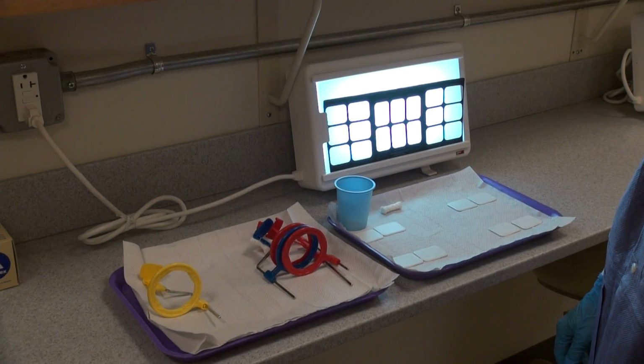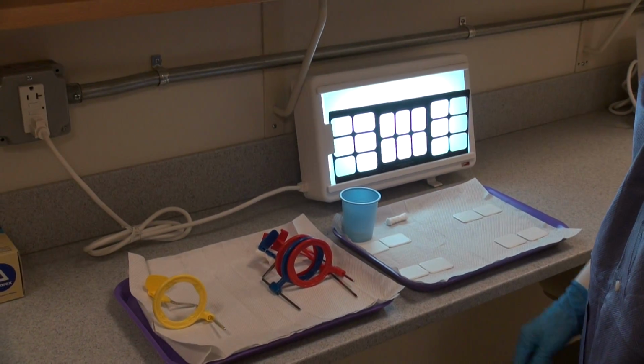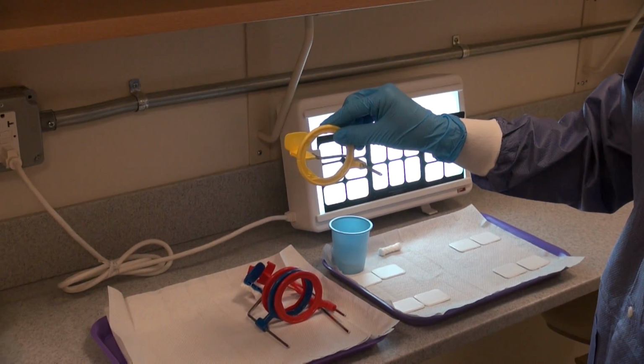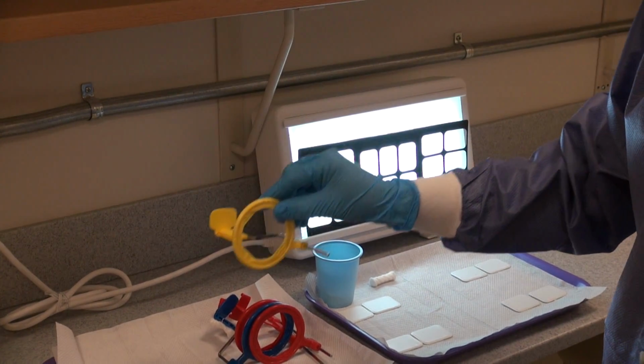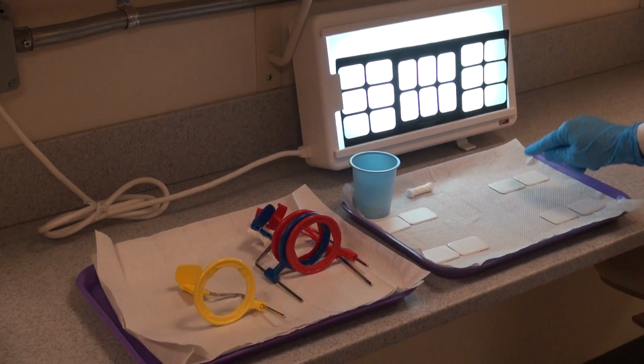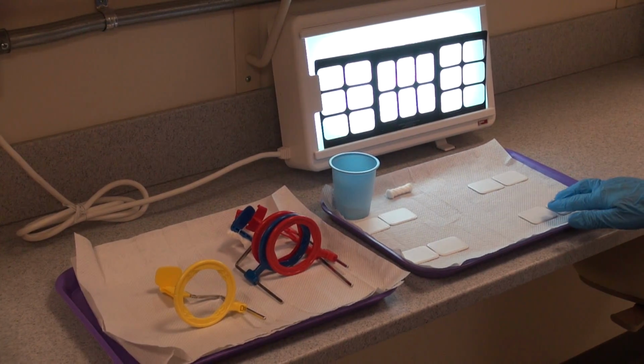In today's session, we are going to be demonstrating film placement for taking posterior periapical images. Within a full mouth series of x-rays, we will take 8 posterior images, 1 premolar and 1 molar in each quadrant.